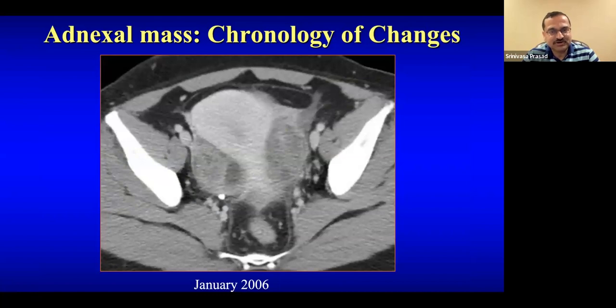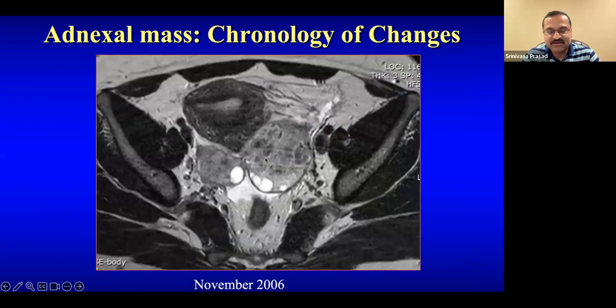And one of the other important things is to go back and look at the images. So this is what happened in this patient. Patient had pelvic pain, and she had what looked like quite plump ovaries. And she subsequently, for monitoring of these so-called plump ovaries, she had an MR, and this is what it looked like. Quite heterogeneous, but somewhat maintained follicles at the periphery of the ovaries. So again, it was again referred to what I refer to as the plump ovaries.